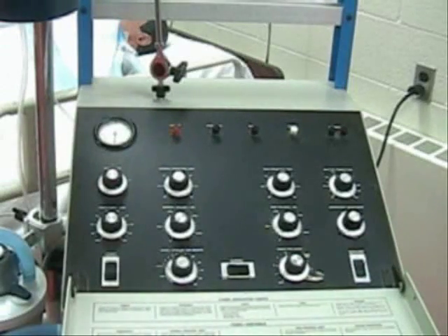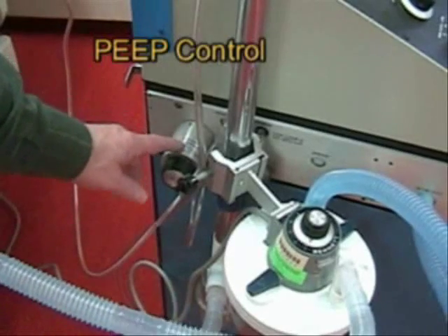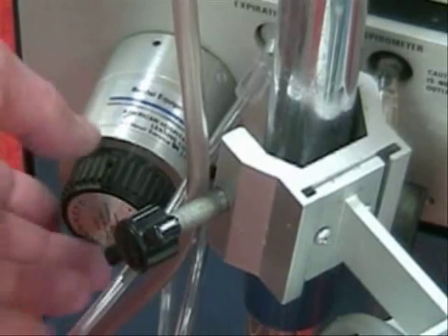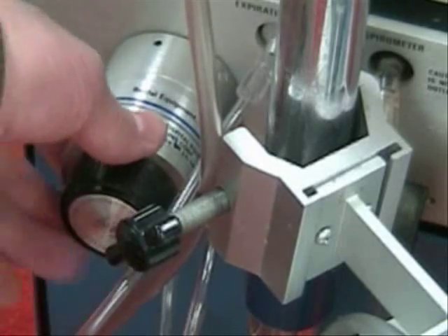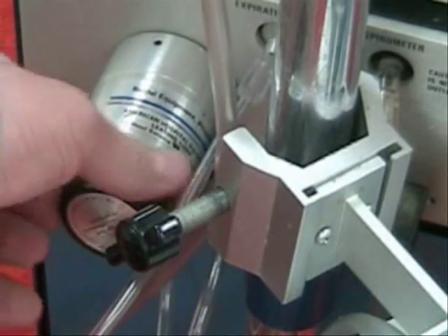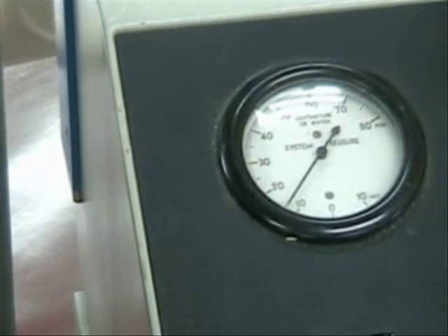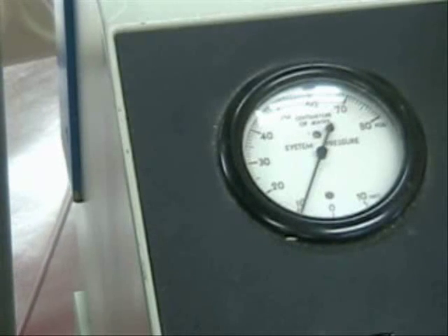That covers all of the controls except for one more: PEEP. We can adjust PEEP over on the side here — that's the PEEP adjustment. This device is what creates our PEEP. By rotating this control knob and watching the manometer gauge, we can set PEEP on the ventilator. Right now it's giving us about 10, so we want to adjust it down a little bit.